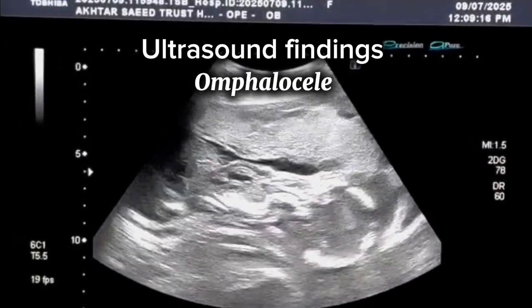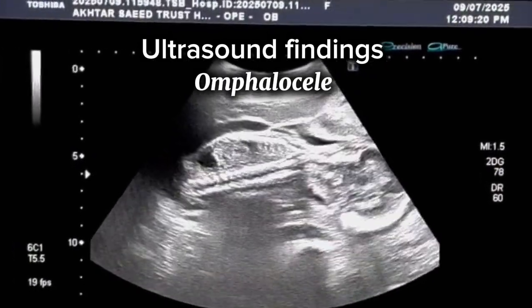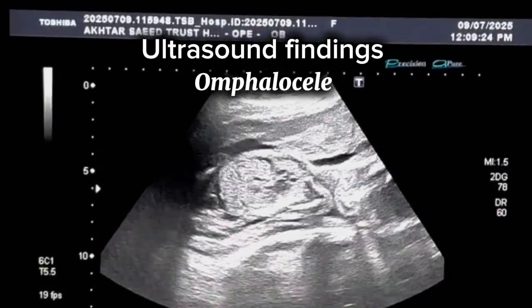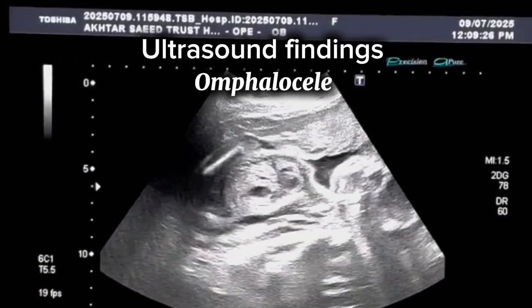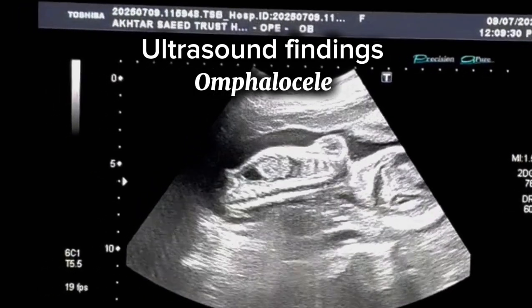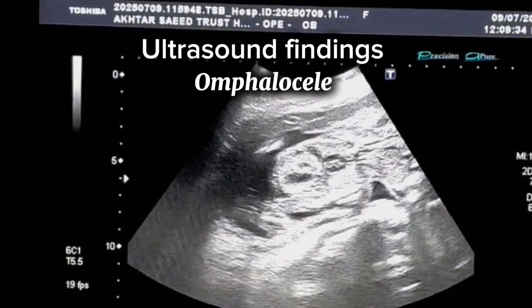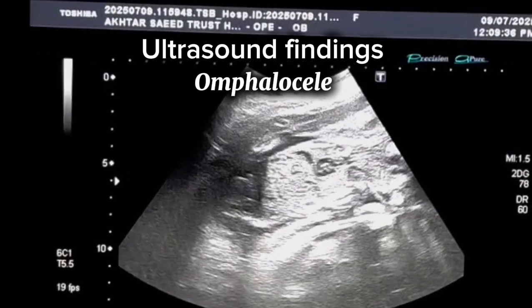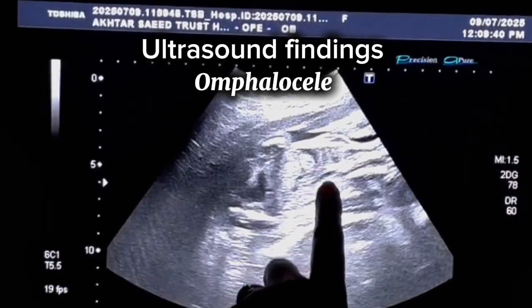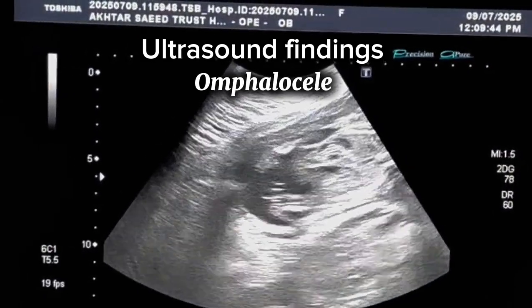On ultrasound, we saw a single live intrauterine fetus with cephalic presentation. Fetal heart rate was normal, 142 beats per minute. A midline anterior abdominal wall defect was identified, located just inferior to the umbilical cord insertion. Herniated bowel loops are visualized, contained within a thin echogenic membrane. Importantly, the liver is not herniated and remains within the fetal abdomen. Findings are consistent with omphalocele.